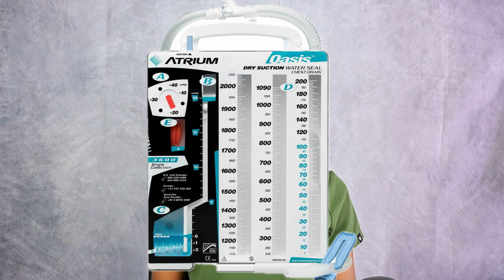So this is what your chest tube looks like. Important things you need to know: this is your suction control, and this is your collection chamber, where you see the fluid being collected, and this is your water seal chamber. This is your tube clamp. You have your air leak monitor here. Please take note, this air leak monitor could bubble continuously, but it should never bubble aggressively. When it bubbles aggressively, then you know that there's a problem.